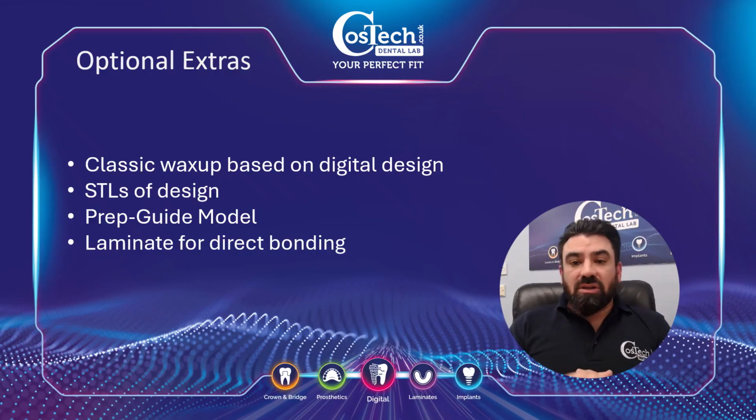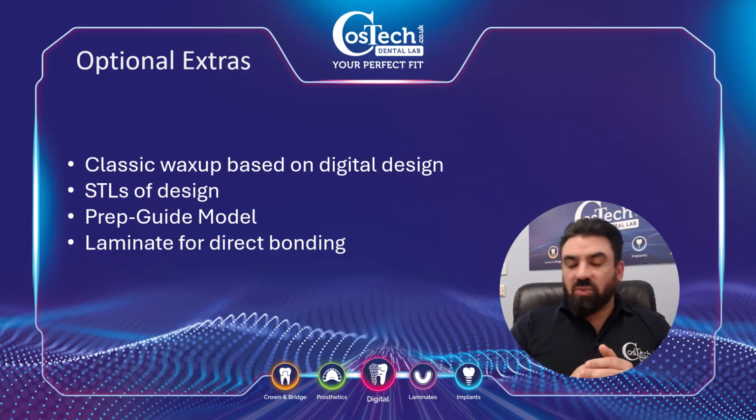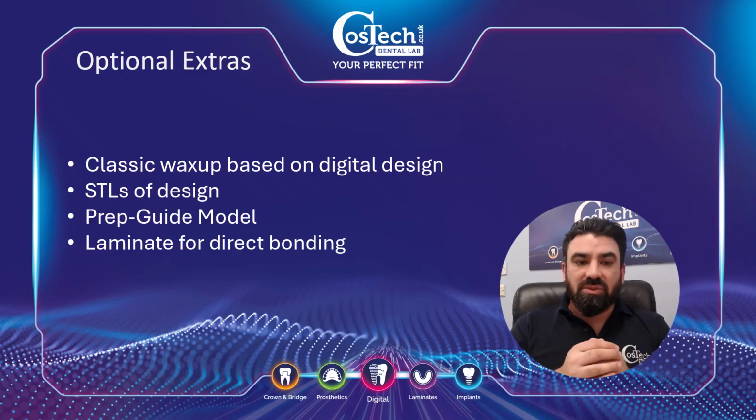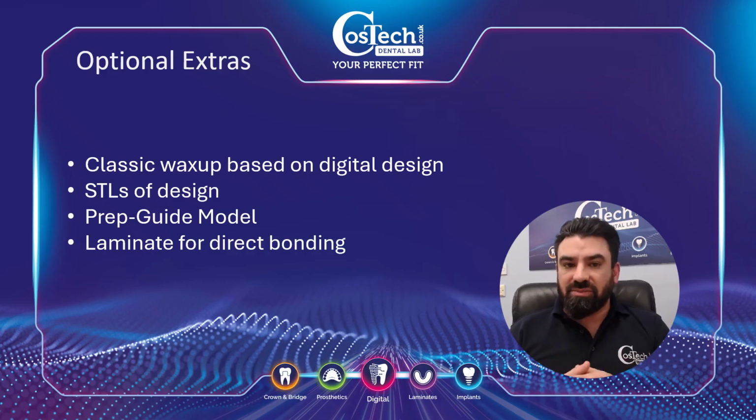Prep guide models are absolutely amazing. If you say, right, I want to have a veneer case, but I don't want to over prep, you want to avoid it as much as possible, with the prep guide model, you layer it straight on and it gives you a guide of how much material to take off. And knowing that as long as you've taken that much off, whatever was decided at the diagnostic design stage, we know that is 100% accurate, that we can actually achieve that.